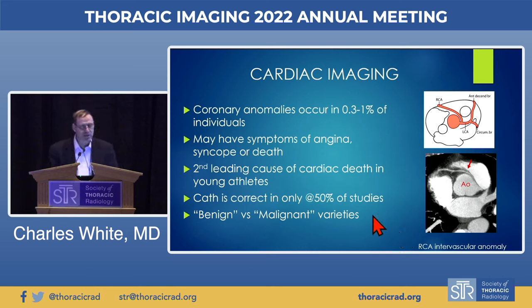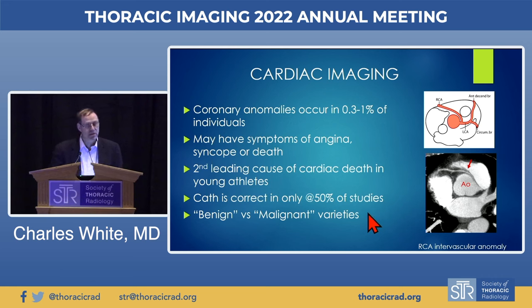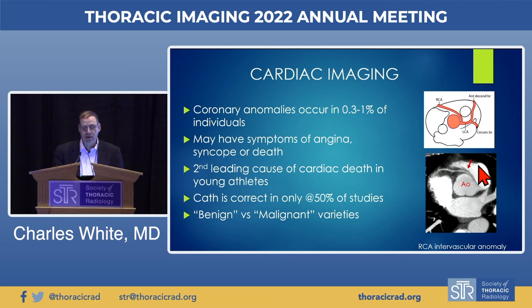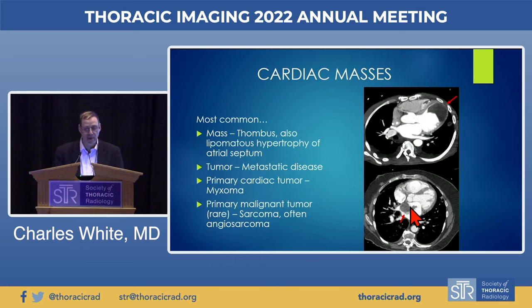Coronary anomalies are very important; they occur in up to 1% of individuals and can cause angina, syncope, or death. After hypertrophic cardiomyopathy, they are the second leading cause of cardiac death in young athletes. Catheterization is correct in only about 50% of cases. There are benign and malignant varieties. Here's a malignant variety of the RCA — if it goes between the aorta and pulmonary artery, that's a malignant variety. It arises from the wrong cusp, going between the great vessels — a malignant course with bad potential outcome.